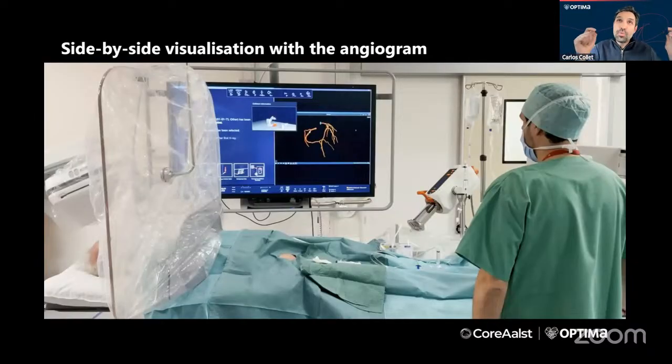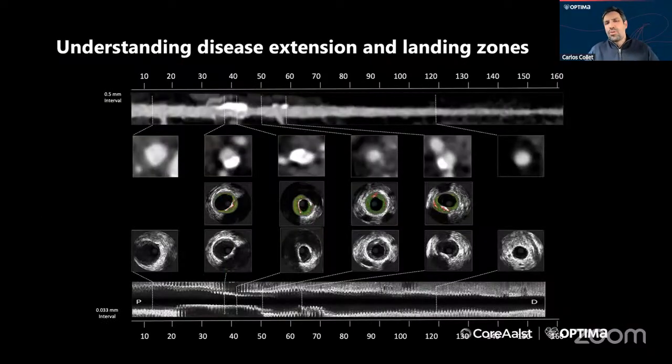But the most powerful part of this is that you can see the plaque in three-dimensional space in the three vessels during the procedure. And that adds a layer of information that is very, very powerful, especially when you have complex disease with a lot of calcification. And there are a number of studies already showing the accuracy of CT when you're trying to look at either plaque volume, plaque burden, or even calcification arc.